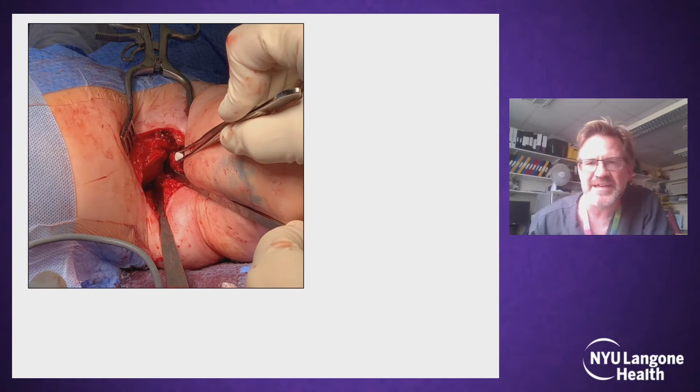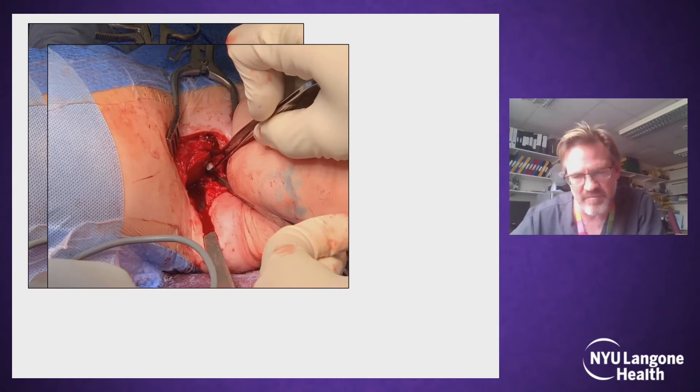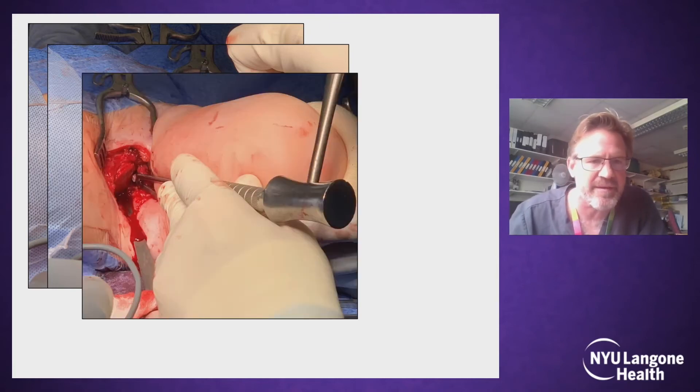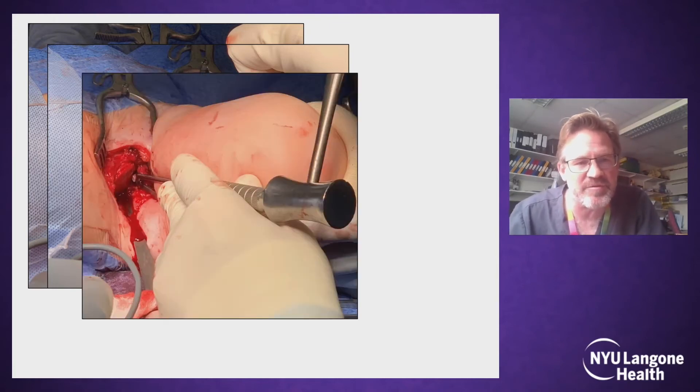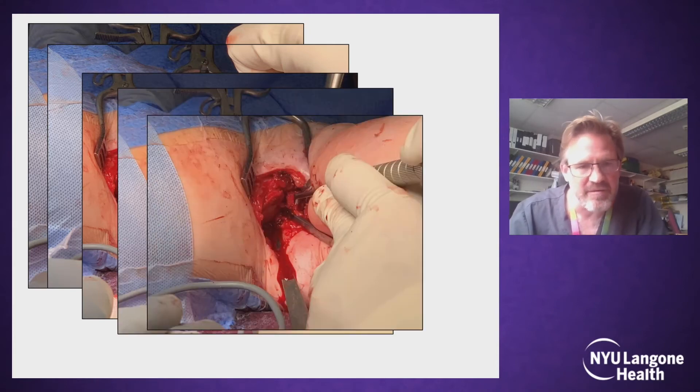I will then take out the anterior osteotome and the little calcium sulfate pellet — which measures three millimetres in height — and place that into the opened wedge, by holding the wedge open with the posterior osteotome still there. And then this is just tapped into place, and it's very stable — tap, tap, tap, in it goes. Then remove the posterior osteotome.